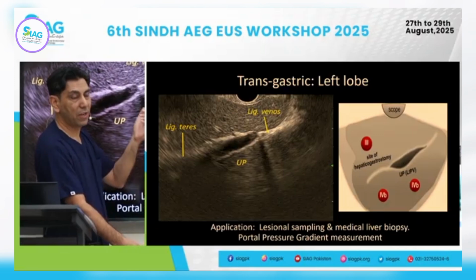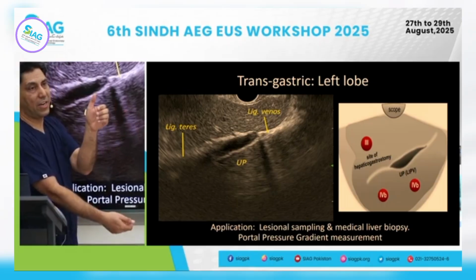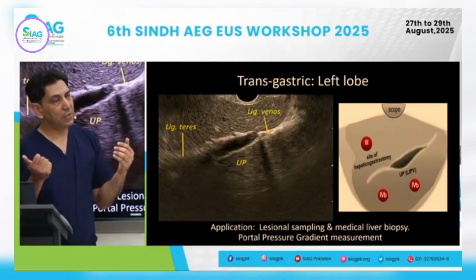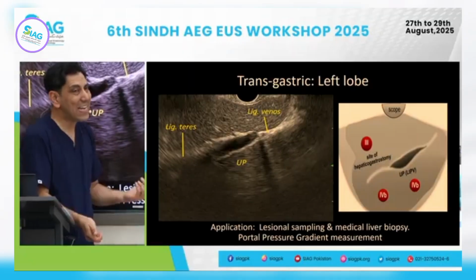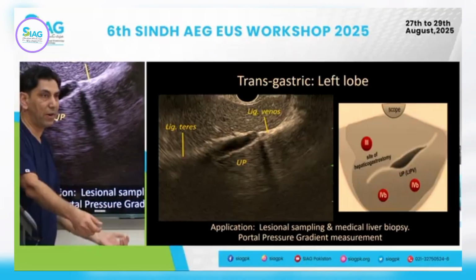And as we advance, we start to rotate. From the left hepatic vein to the middle hepatic vein, and from the middle hepatic vein to the right hepatic vein. That's not going to happen in every case. You may have to withdraw the scope ever so slightly, coming back to the intrahepatic portion of the IVC, but in at least 6 or 7 out of 10 cases, you should be able to see the left hepatic vein, middle hepatic vein, and right hepatic vein, literally by doing this.